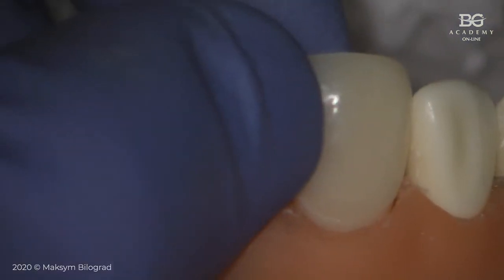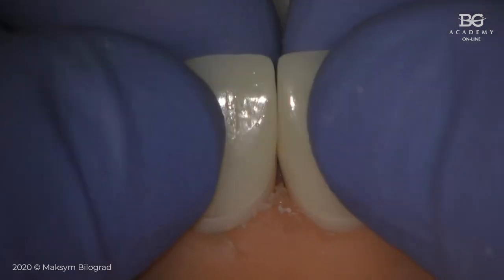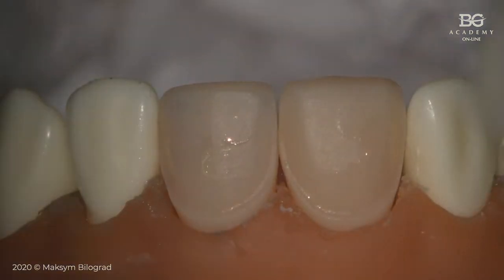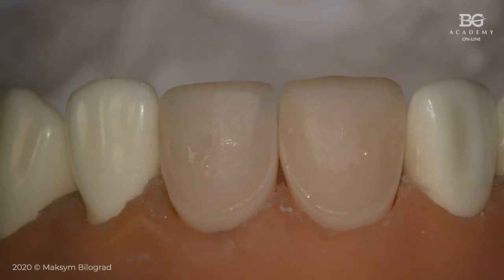So before you put the rubber dam, we can make some adjustments if it is necessary. Like in this case, we can make some adjustments. What kind of adjustments can we make? We can take an articulator paper, a really thin one. I like to work with Artifoil 8 microns. Let me just show you here.